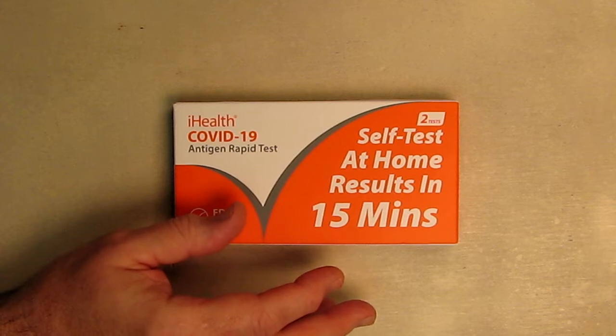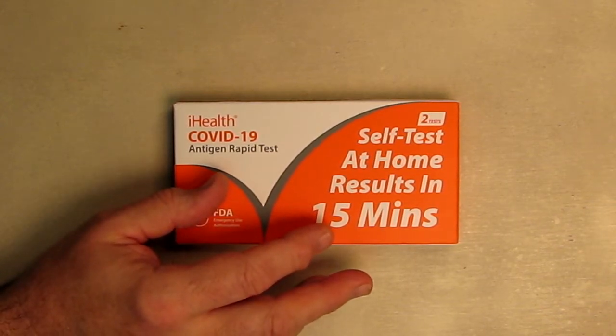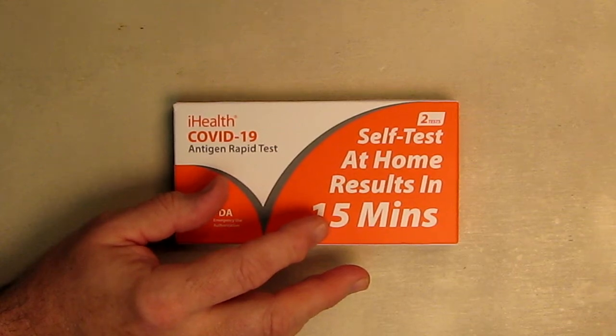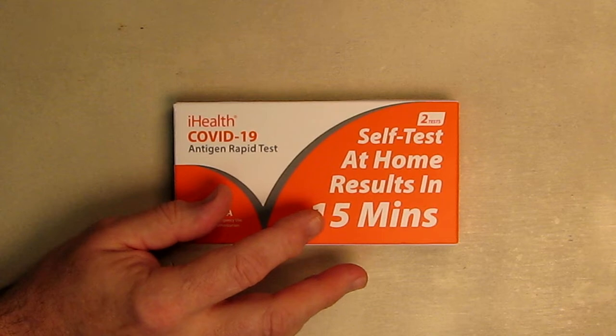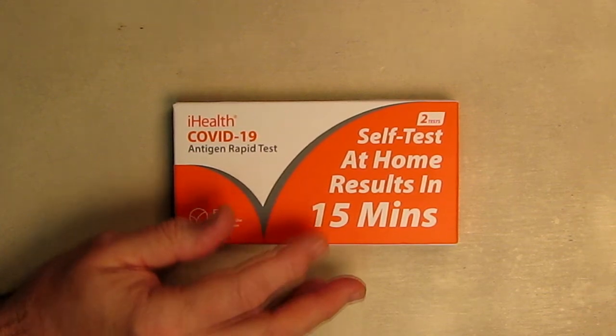It's FDA authorized, takes only 15 minutes, and you don't need a lab. It's simple to do but there is a specific set of instructions. There's no discomfort because you don't have to go really high up — you just rotate the swab in your nostril about a half inch to three quarters of an inch. This works for ages two and above, and it's really an excellent product to use.